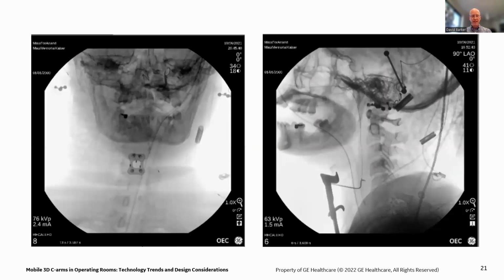And if we take two X-ray images at 90 degrees, this allows the doctor to build a three-dimensional model in their head of what they're looking at. And just by taking two shots, which take very little time, orienting things at 90 degrees, they're able to get these two shots, build a three-dimensional picture, and make a decision. What they're doing is a poor man's three-dimensional map in their head with just these two shots.